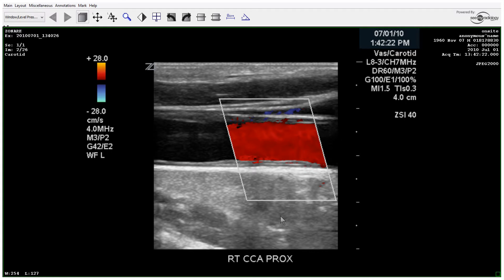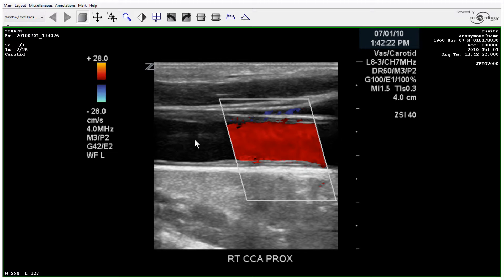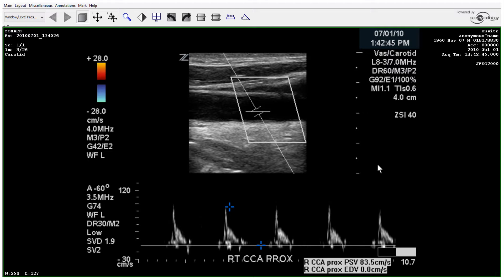You could turn down the overall 2D gain here — it's a little bright posteriorly — and that would also involve possibly turning down the TGCs to get rid of some of this artifact within the artery lumen.